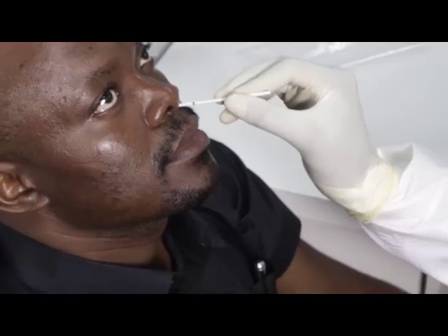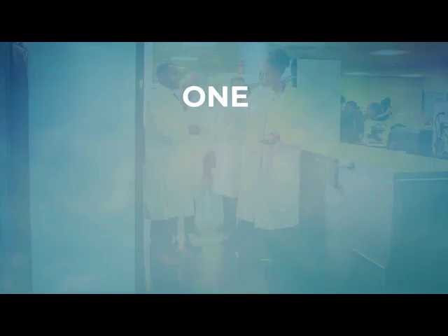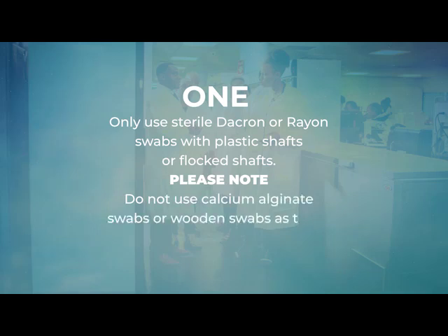There are two main points to highlight prior to the demonstration of these techniques. One, only use sterile Dacron or Rayon swabs with plastic shafts or flocked shafts. Please note, do not use calcium alginate swabs or wooden swabs as these may inactivate the virus.